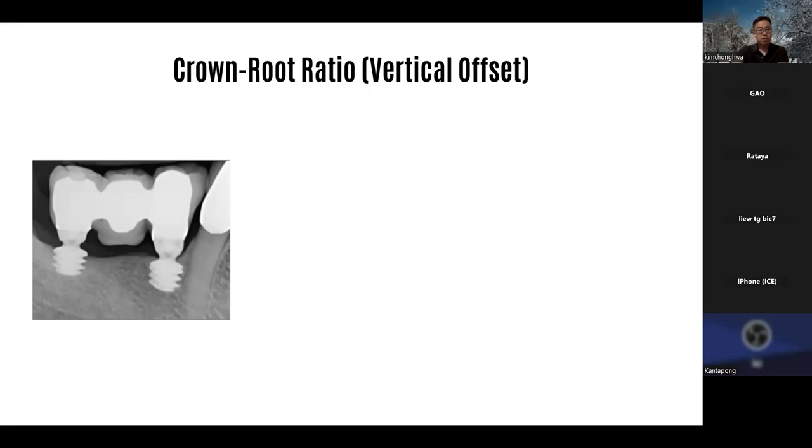So in this particular case, this is not my case, but you could have used a little longer implant because the nerve is down there somewhere. We'll still have some space for implant, but for some reason, in this case, they've used quite short implant, which will make quite unfavorable crown root ratio, and that'll make the screw loosening even easier.